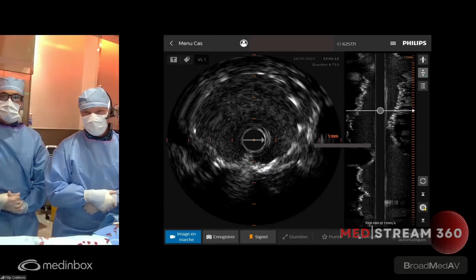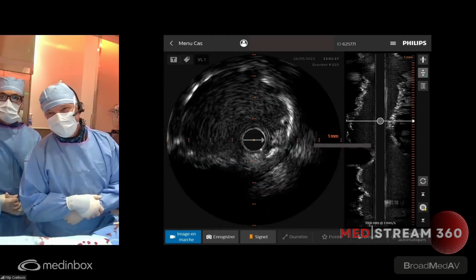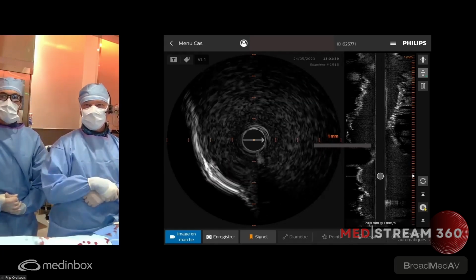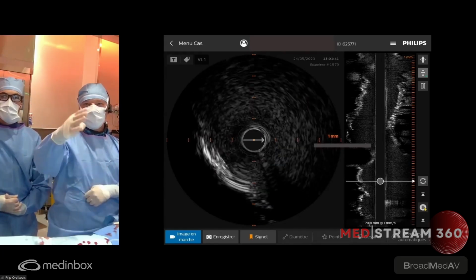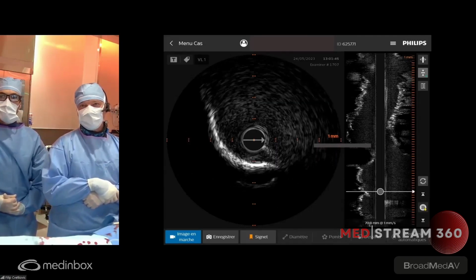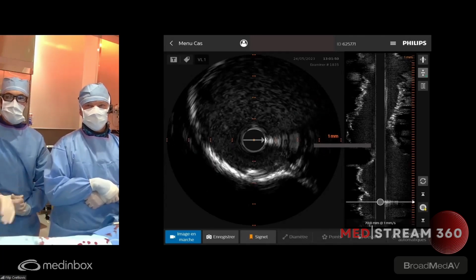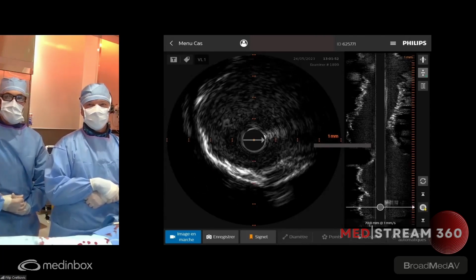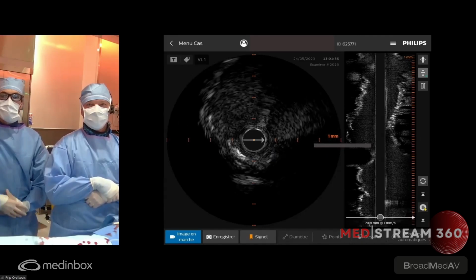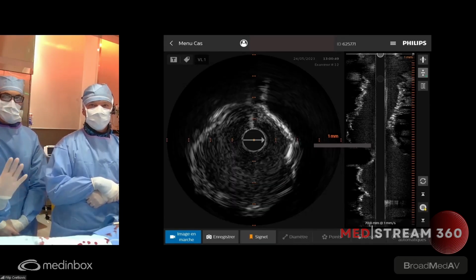The apposition is good. It's really circular. The two diameters are not the same. We're in the very, very large aneurysm right now, so it's not possible to see all the artery, just one part. And even with OCT, we could not flush very well, so we did not want to use OCT. Initially, we discussed that. We thought that IVUS could give us enough information in this case. And to my eye, it looks pretty well apposed, within the two aneurysms.